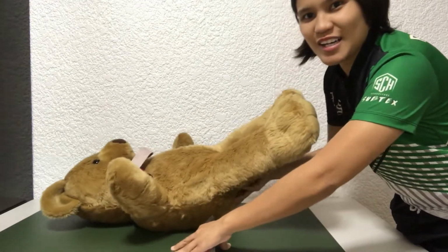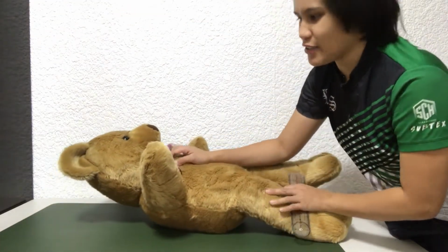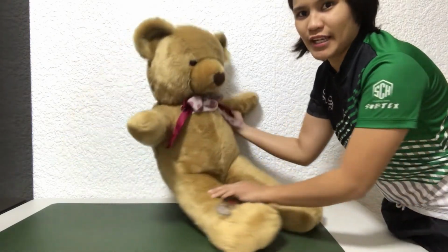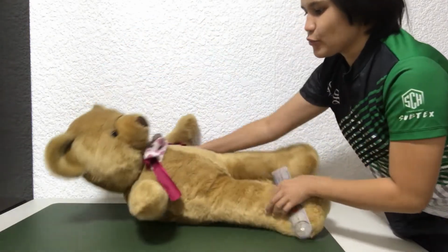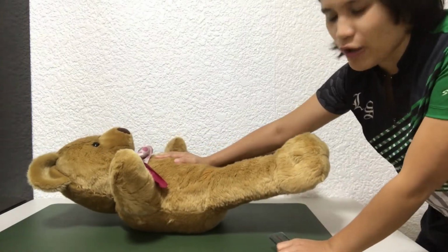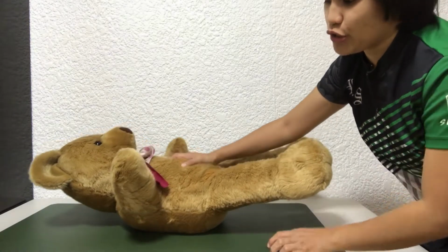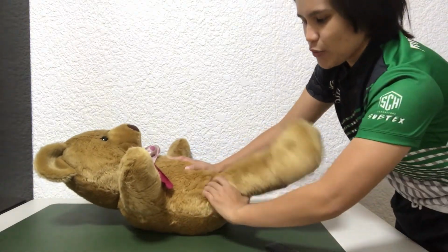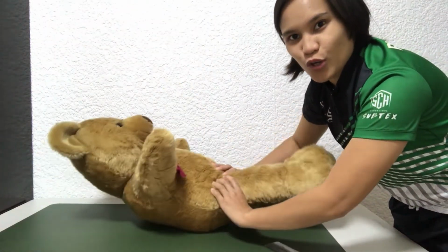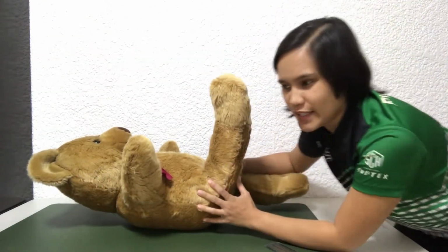Okay, so everyone, I don't have an available patient right now, but I have Mr. Teddy. So we will try to provide an example of how we use the goniometer for measuring the range of motion. For example, we want to measure the range of motion of the hip joint of Mr. Teddy.